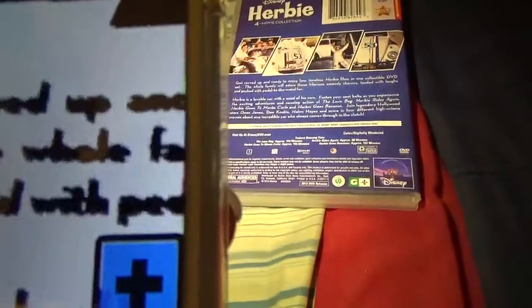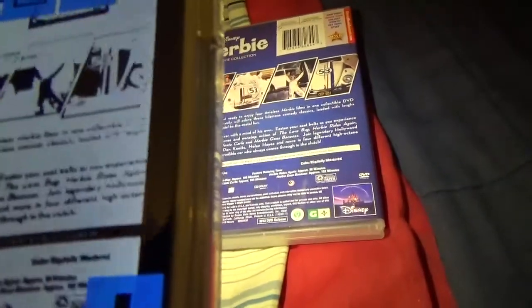So let's take a look here. We can see, get revved up and ready to enjoy 4 timeless Herbie films in one collection, or one collectible DVD, and so on and so forth. You get the idea. So what we can do is zoom out. Decrease zoom button. Decrease zoom. So 1x.